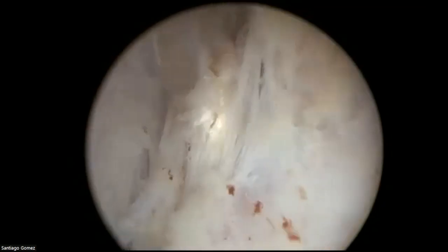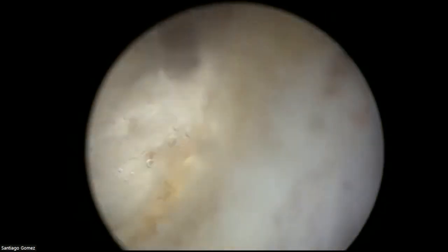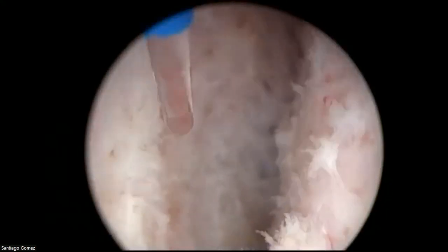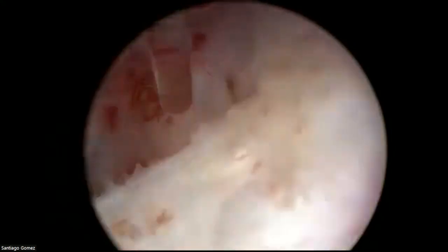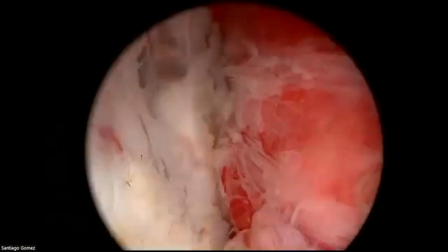So here, what I'm trying to do is to be careful as I dissect the apex, by releasing the apical attachments first, and then trying to mobilize the apex. You see that, for example, here, if we want to come up, there is a very nice space because we have mobilized the apex. And when I want to come towards 12 o'clock, and here's the 12 o'clock mark that we marked at the beginning, we have some space and some orientation because we mobilized the apex.